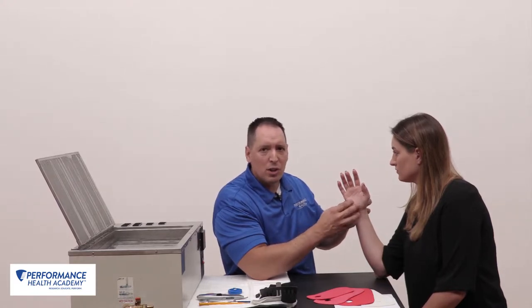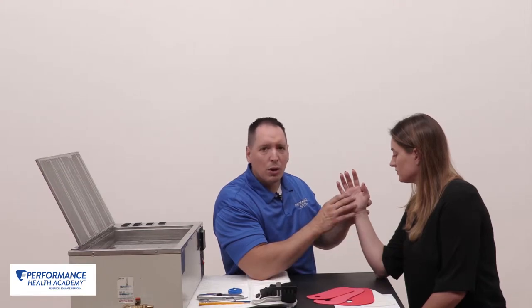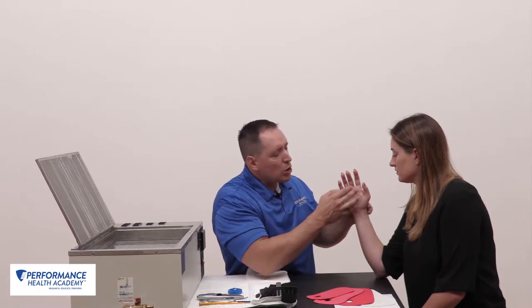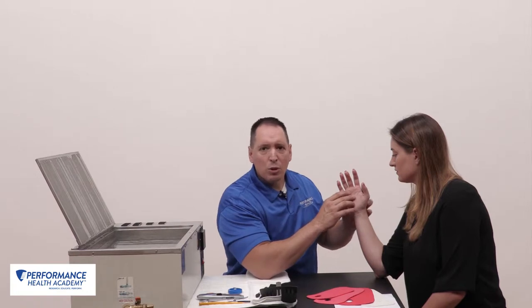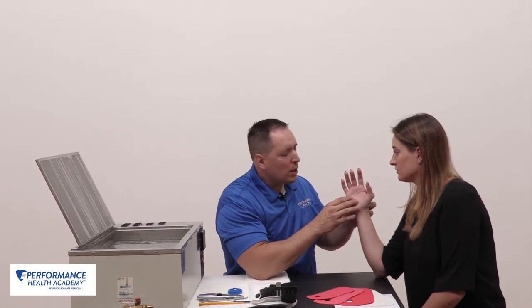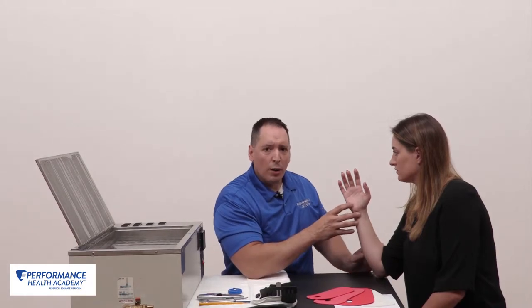You can see their facial expressions to make sure you're applying just the right amount of pressure or the material is not too tight. By this point, my material should just be about ready. This is eighth-inch aquaplast, so it has 100% memory. We're going to show you how to roll out that thumb and take that splint material out of the water.